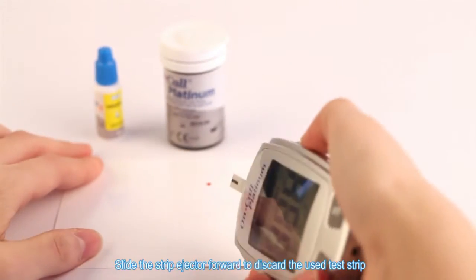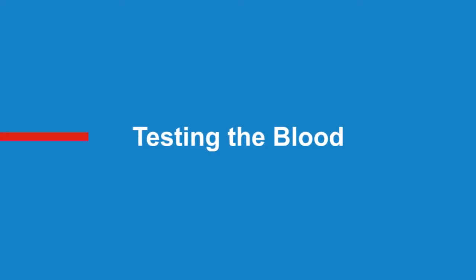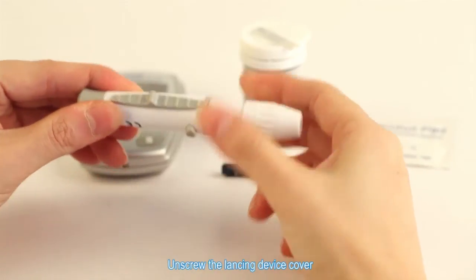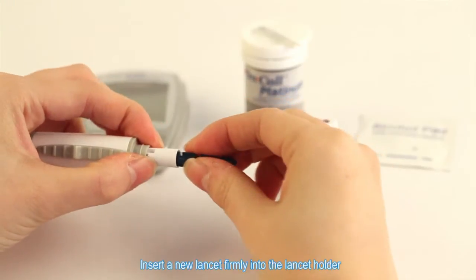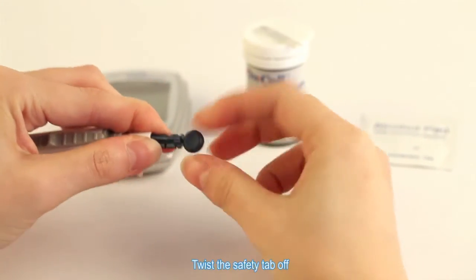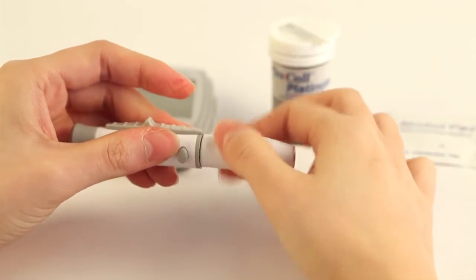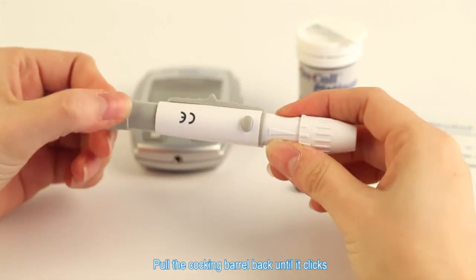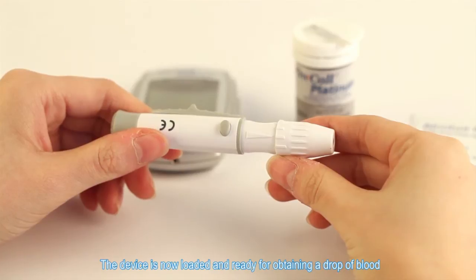Slide the strip ejector forward to discard the used test strip. Testing the blood. Unscrew the lancing device cover and insert a new lancet firmly into the lancet holder. Twist the safety tab off. Carefully screw the lancet cover back on. Adjust the puncture depth by rotating the lancing device cover. Pull the cocking barrel back until it clicks. The device is now loaded and ready for obtaining a drop of blood.